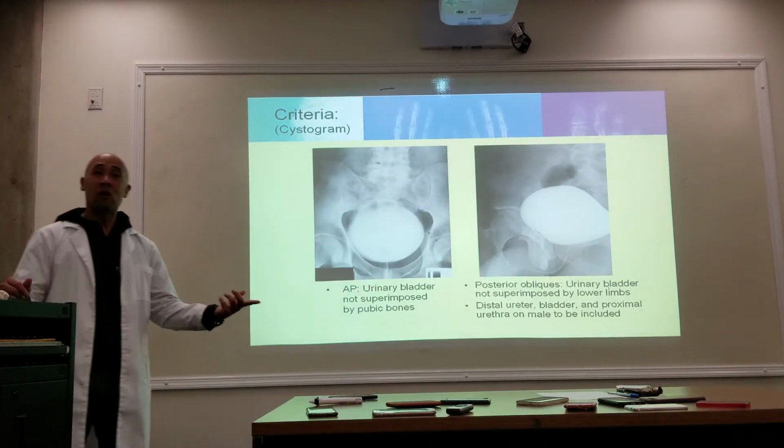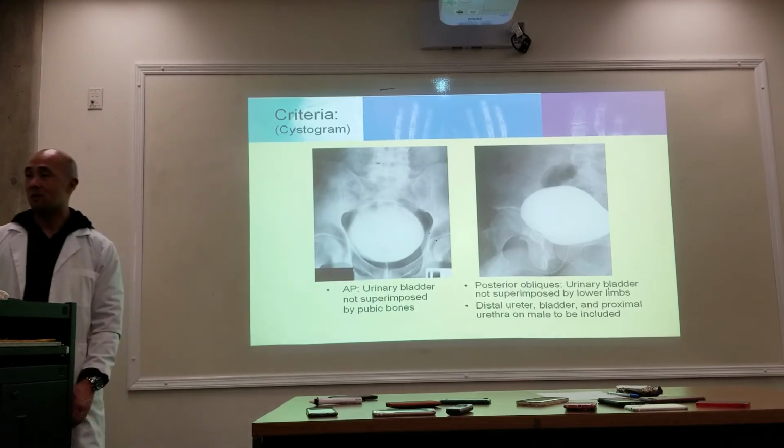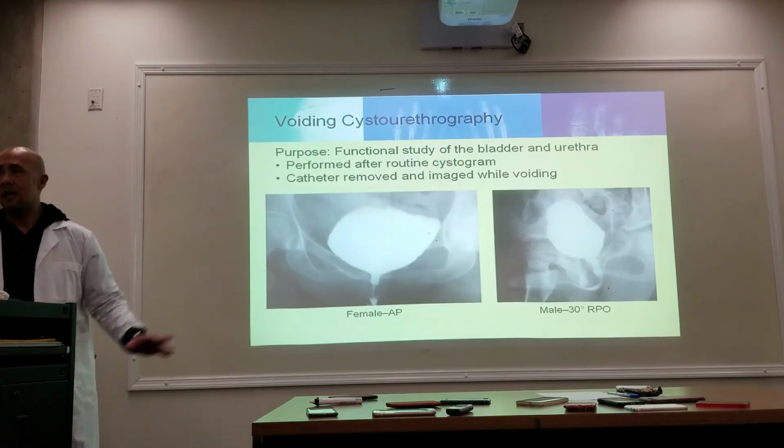Okay. The post void wasn't a big deal because the bladder was empty, and that's why we do it prone. That was a good question. All right, so read that.